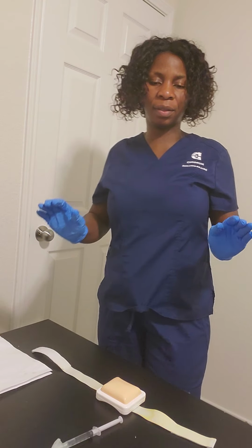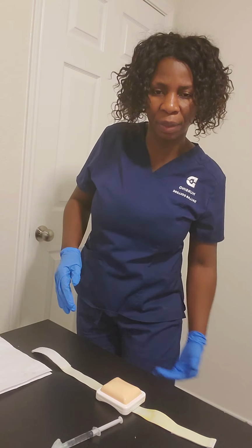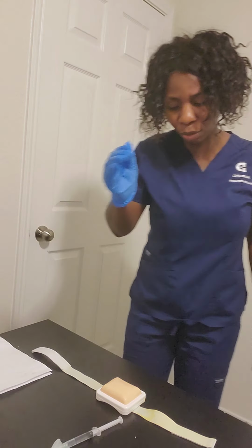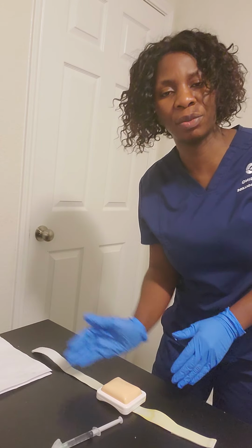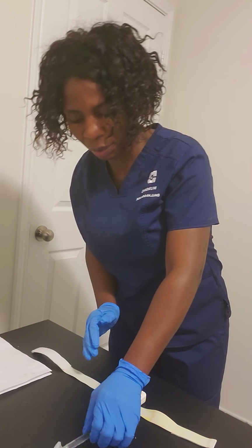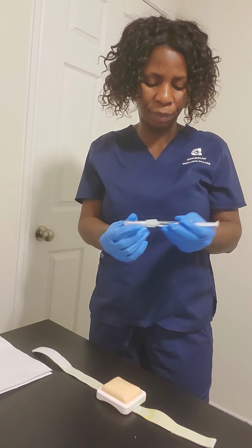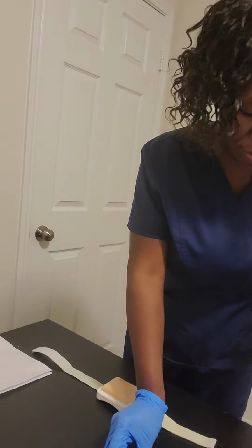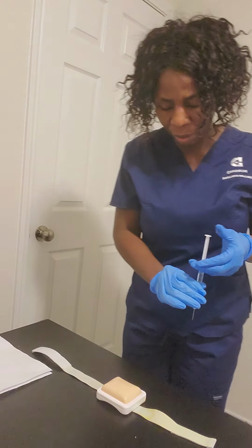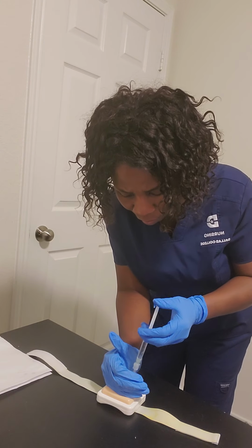Then for the last injection, which is intramuscular, I'm going to tell my patient I'm going to be administering that in a fleshy part, which is the vastus lateralis. I'm going to be using my hand to hold some flesh, so that when I finish administering, the other flesh will be left to cover the other part. So I'll be going in 90 degrees and in a zigzag direction. So I'm going to take off the cap, and I'll use my hand to take the flesh this way.